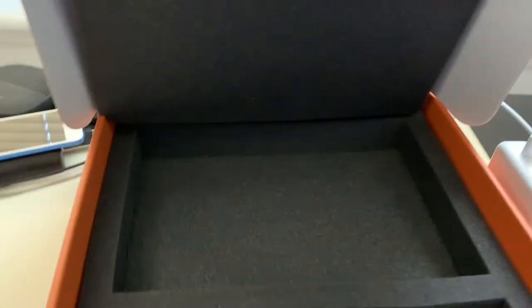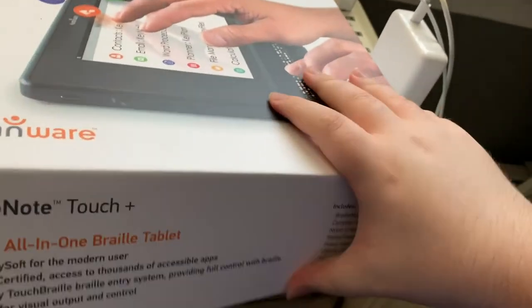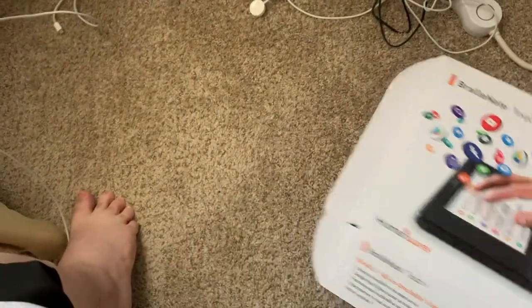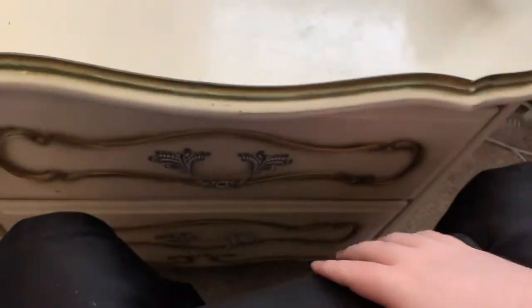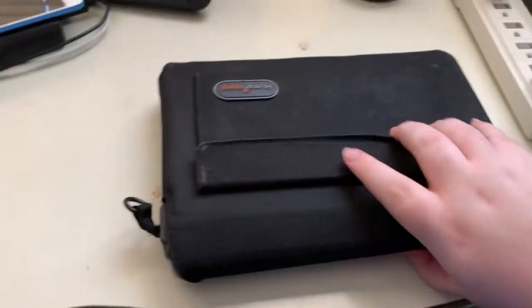I have removed the BrailleNote Touch Plus from the box. I'm going to put it on my lap for a minute and close this box up. That looks so good — I love that box. Now let's look at the Touch Plus; I am getting very excited. I'll do a full description separately, but this is just me taking a first look.